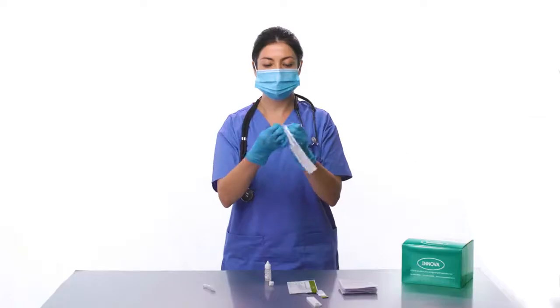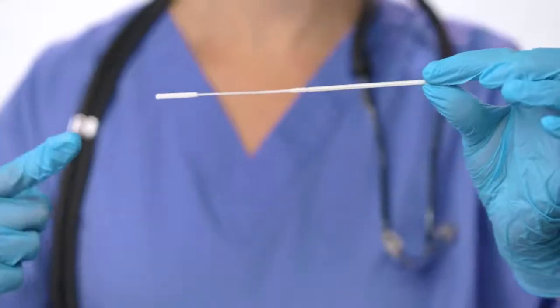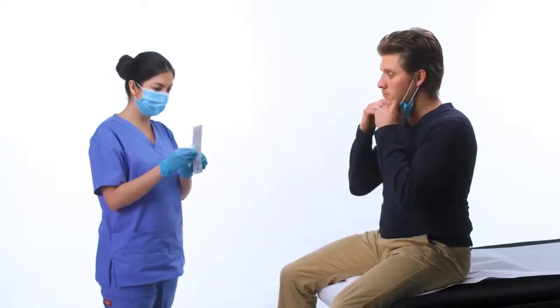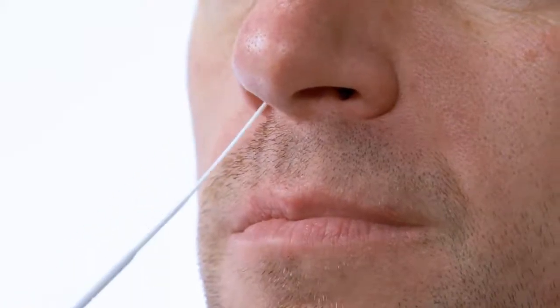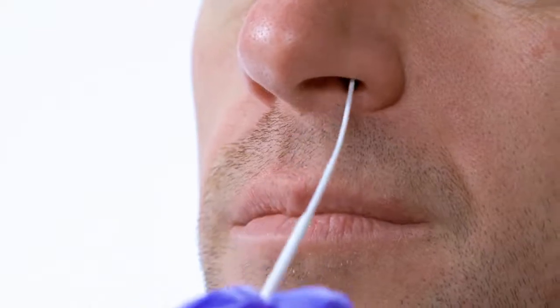Remove the extraction swab from its packaging, being careful not to touch the head of the swab with your finger or any other surfaces. Insert the swab about one inch into the nostril and roll it around, making 10 complete circles around the interior of the nostril. Repeat the process in the other nostril, making sure that you swab both nostrils thoroughly.